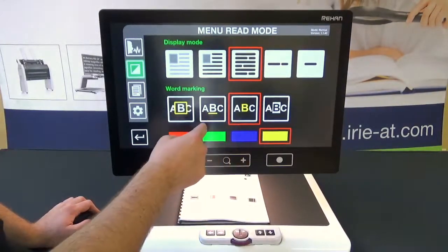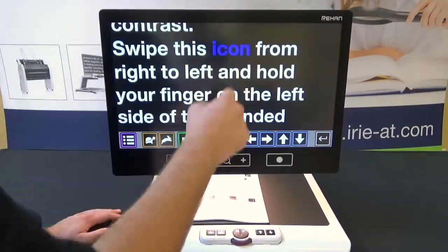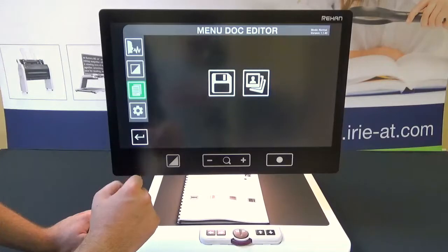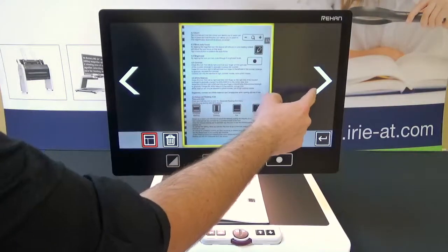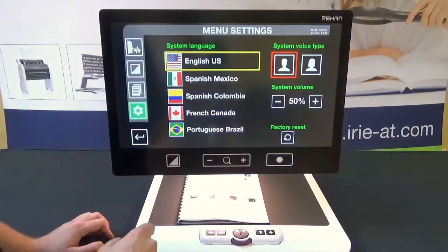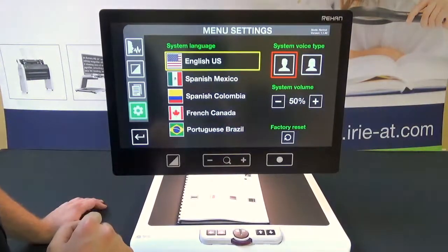I'll set it to highlight words and change the highlight color to blue. Now all the text is digitized rather than showing the original image, and as it plays you can see the words are highlighted as it reads. Back in the menu, you can save a document — pressing save takes the picture and saves it to the photo library. If you have multiple saved documents you can use the left and right arrows to navigate through them and pull one up at any time. In settings, you can choose your system language — Spanish, French, Portuguese, and others are available — as well as system voice, system volume, and a factory reset option.